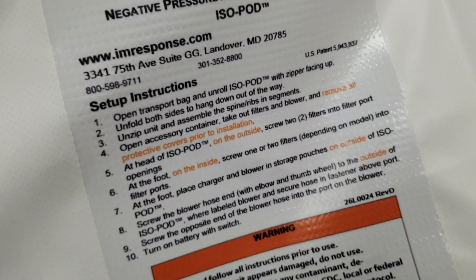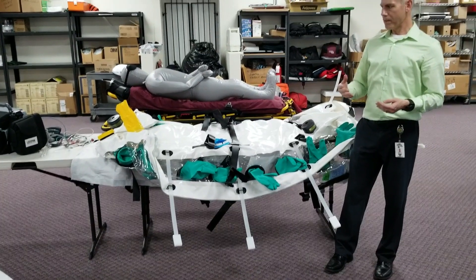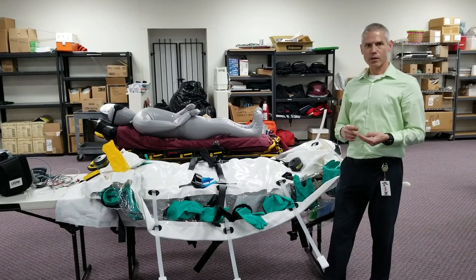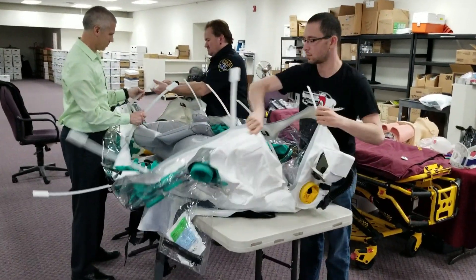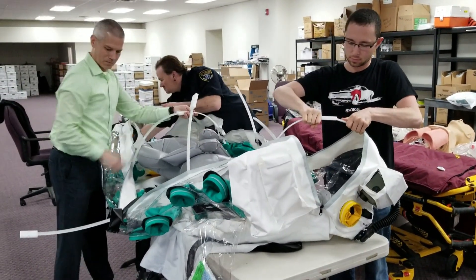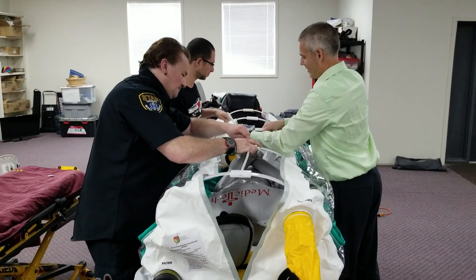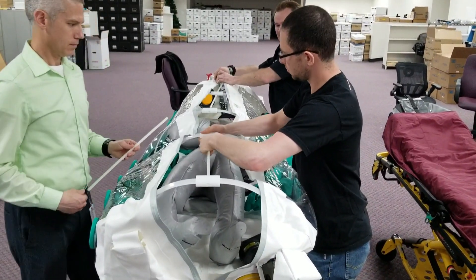This is called an isopod and its purpose is to contain a wet patient — a patient who is actively vomiting, having diarrhea, bleeding, or in some way oozing infectious materials that we don't want to expose our rescuers to, or that our standard personal protective equipment isn't sufficient to protect us from. They are invaluable if you have a patient who is highly infectious.